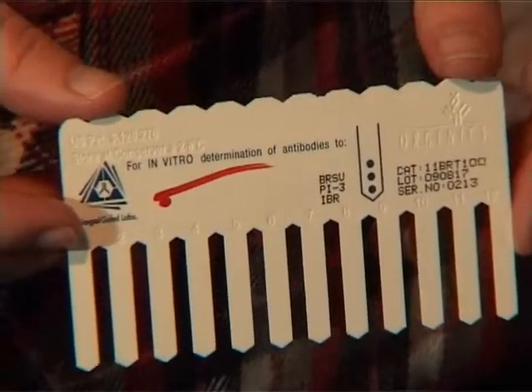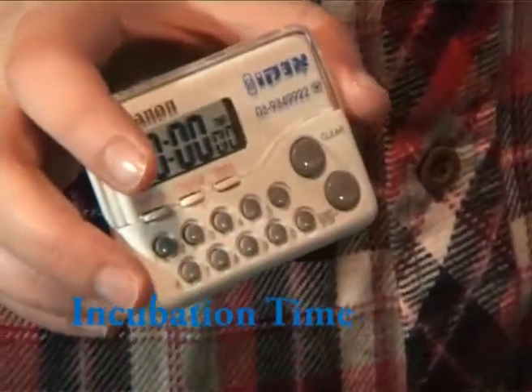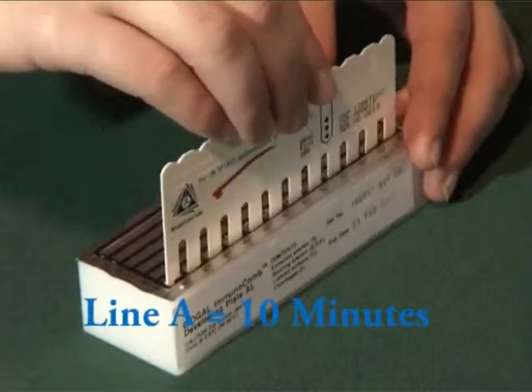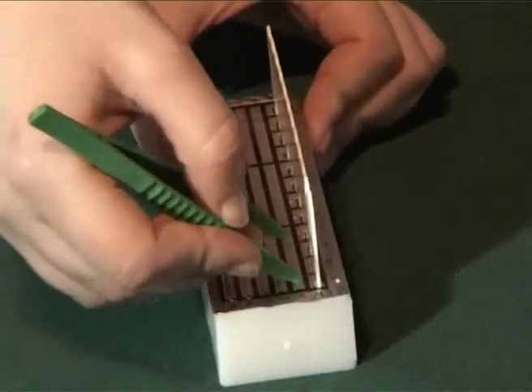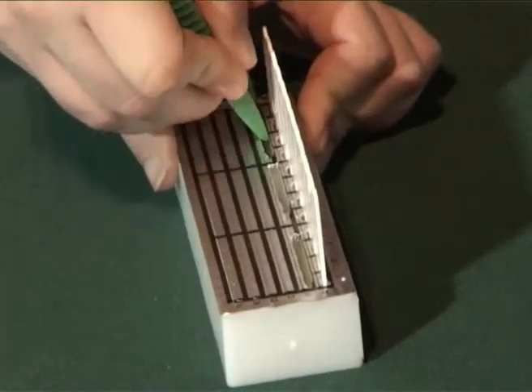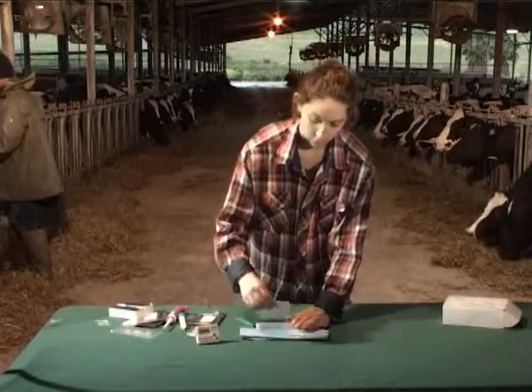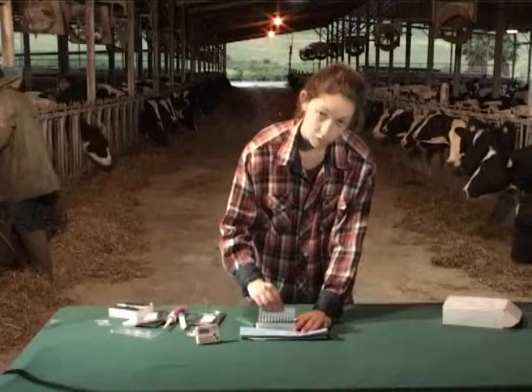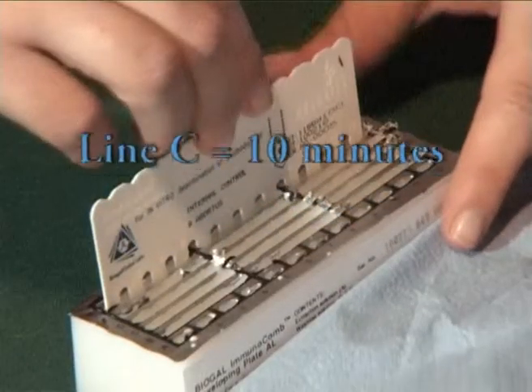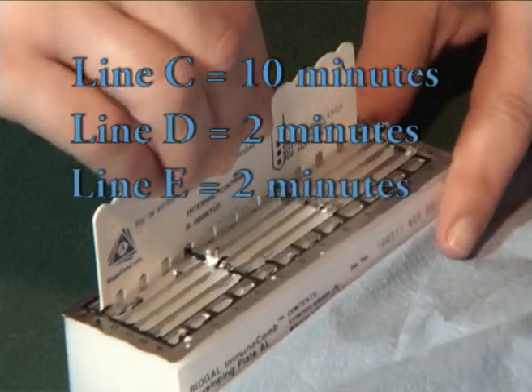Insert the comb in line A and develop for the times stated in the instructions. During the process, gently move the comb up and down. Punch line B, remove the comb from line A, and remove the excess liquid using a piece of paper. Dip the comb in line B and proceed in the same way as in line A, and continue to complete the process.